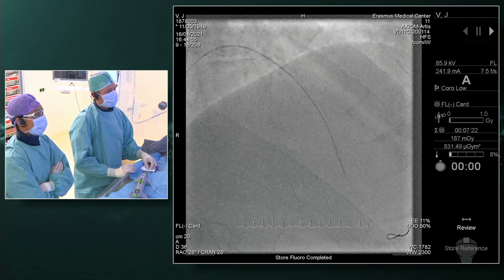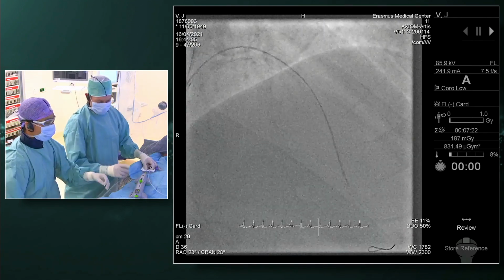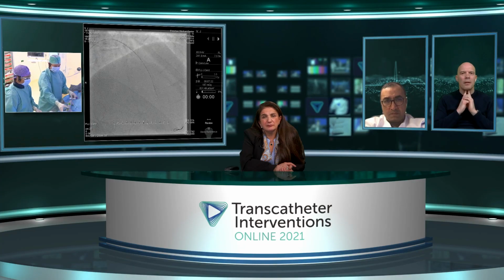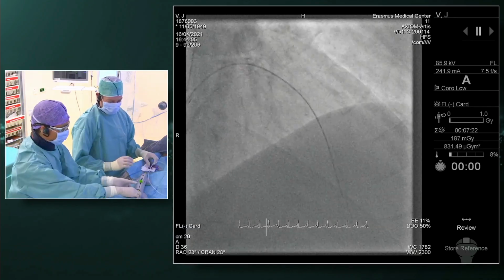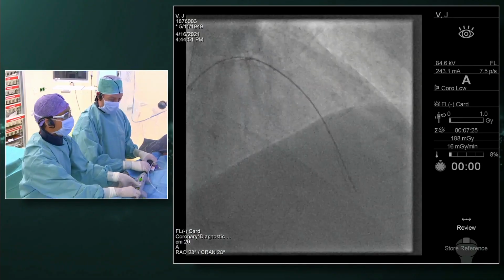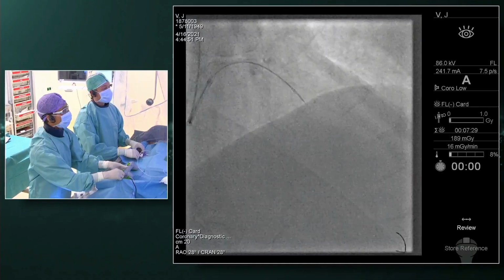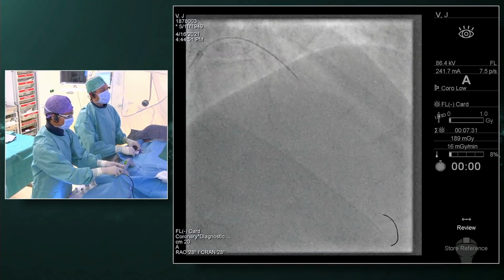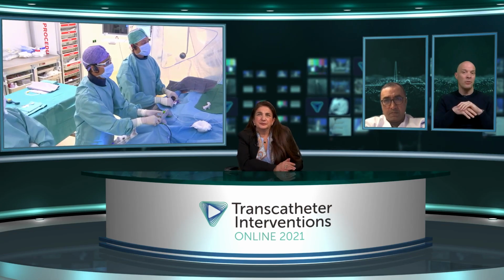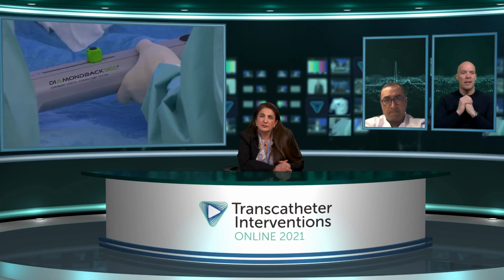We'll keep it with that, and then we go proximal, where we probably need to do a little bit more. Yeah, I agree. So we put the device again on glide assist, and then Wijnand can take out the device. That's a fundamental difference from Rota, that you also deliver therapy as you're coming back. So you sand going forward and moving backwards. That's also of interest, and maybe can also reduce the risk of getting trapped in the calcium.